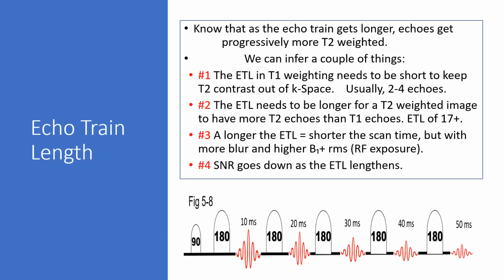When it says it's SAR'd out, it means that pulse sequence that you're trying to run has got too much RF in it. The SAR level is a line that the scanner doesn't want you to go above with this particular sequence. You're going higher or above, you're exceeding the FDA limits. Okay, that's what SAR means.